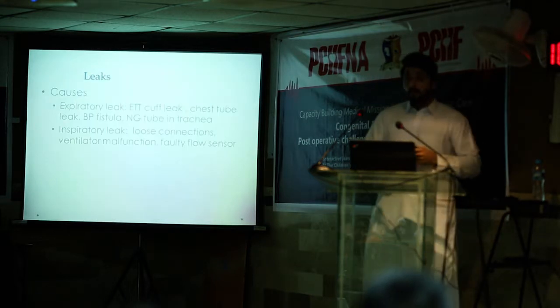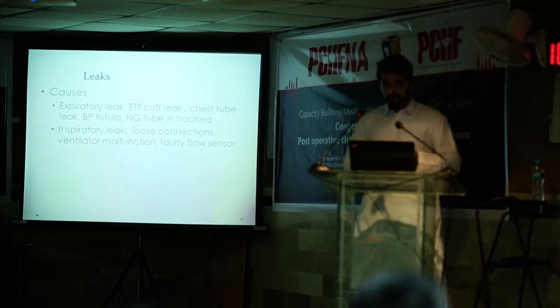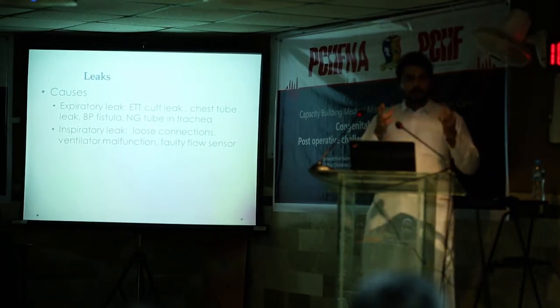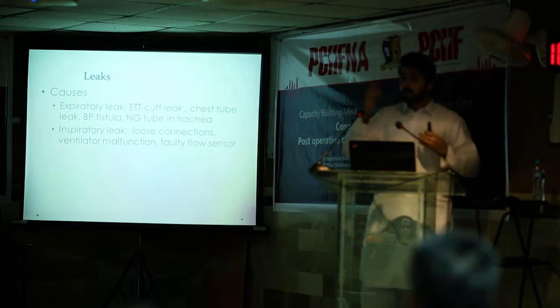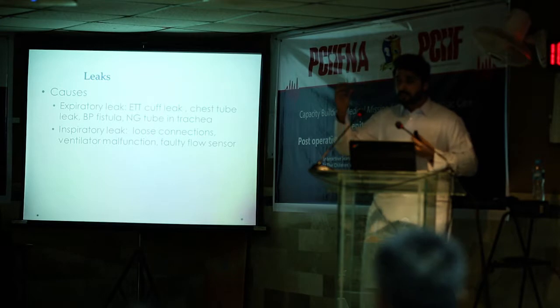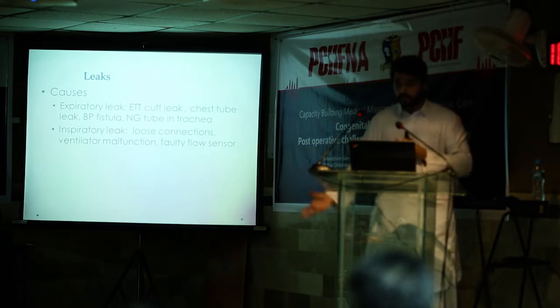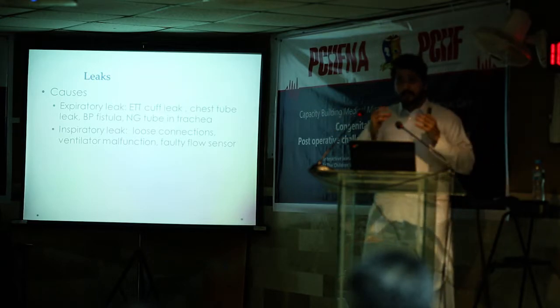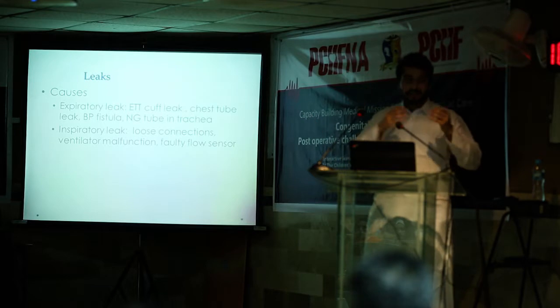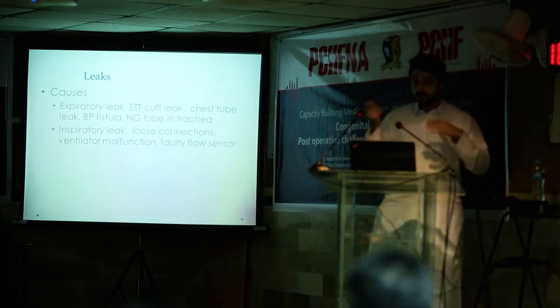Leaks are one of the main things that we should troubleshoot. Sometimes the ventilator will alarm, people will not give attention, and it causes big problems for the patient. Because if there is a leak, that means the patient will not get the volume. For example, a pediatric patient needs volume to wash out the CO2. If there is a leak and we just see the alarms and don't care about that, the patient will not get the tidal volumes. That means a buildup of CO2, which could cause CO2 narcosis, and could cause arrest because of the H ions.